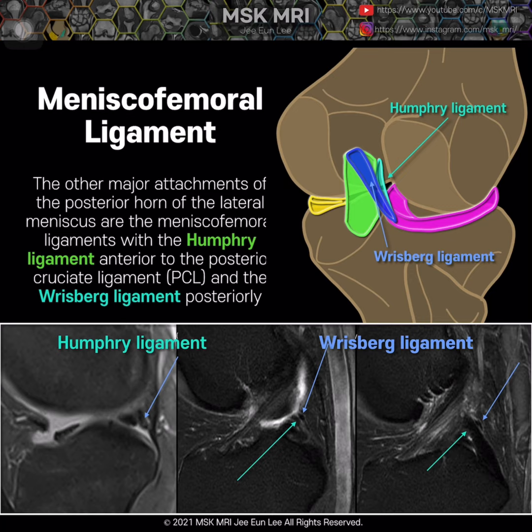Here on this image, meniscus femoral ligaments may mimic a peripheral longitudinal tear, but can be differentiated by following these structures on serial images.